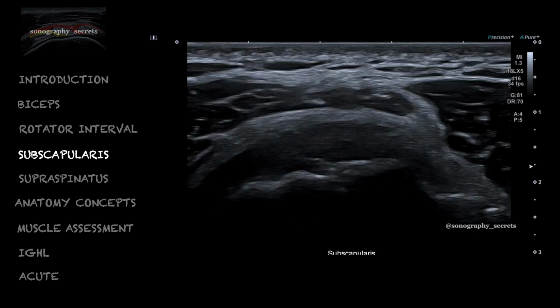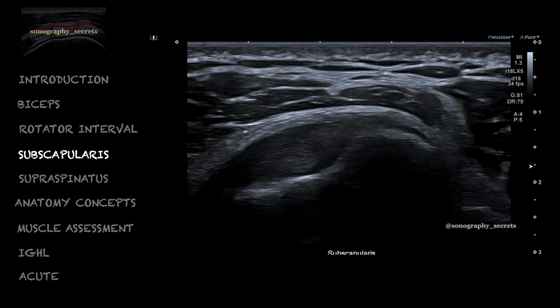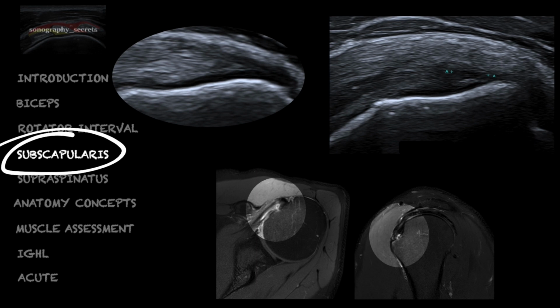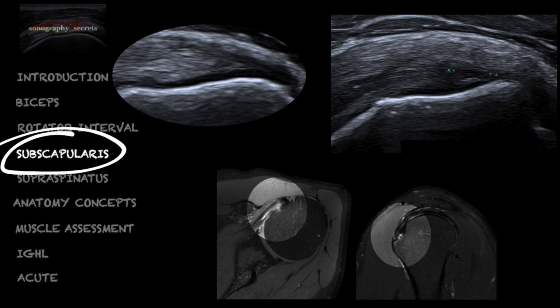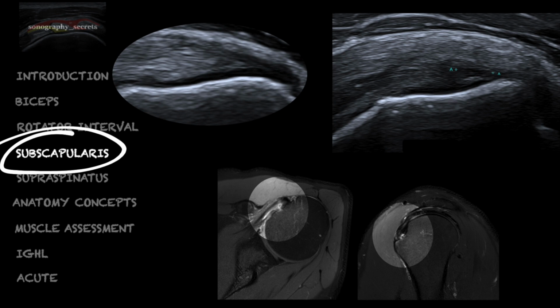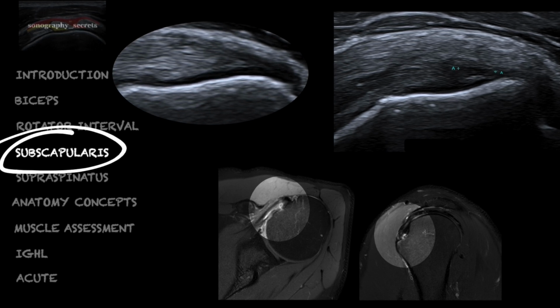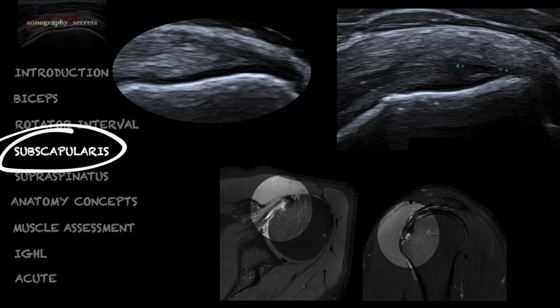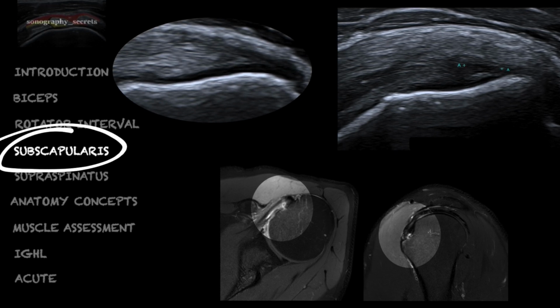This case, if nothing else, illustrates just how difficult shoulder ultrasound can be. I still maintain that shoulder ultrasounds are the most difficult MSK examination that we perform, but far too many view ultrasound simply as a means to assess for bursitis and impingement, whatever that is. The intricacies of the anatomy and pathology are often overlooked and underappreciated.